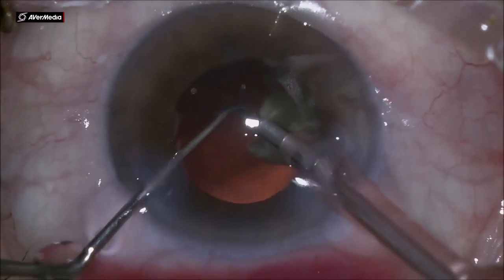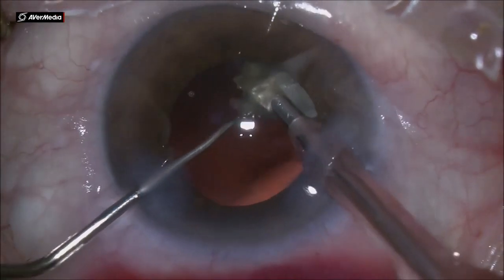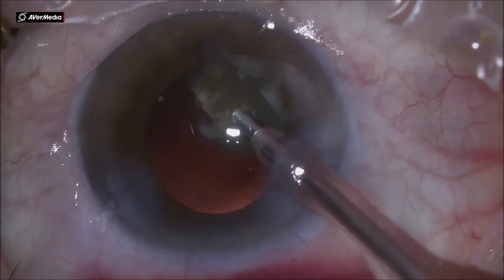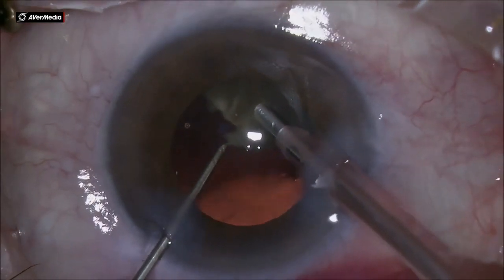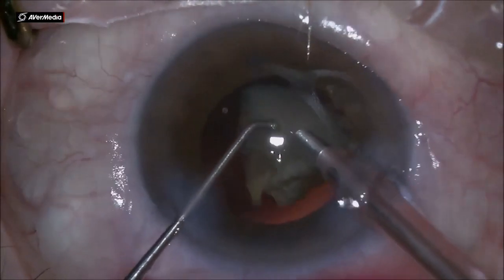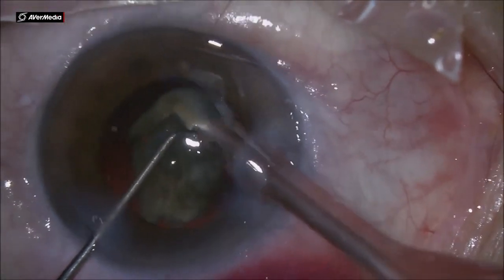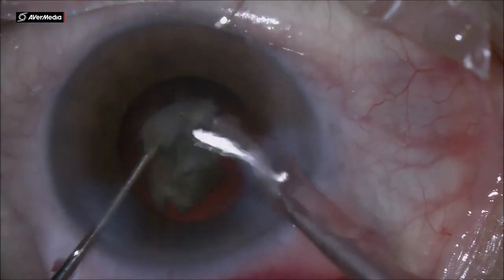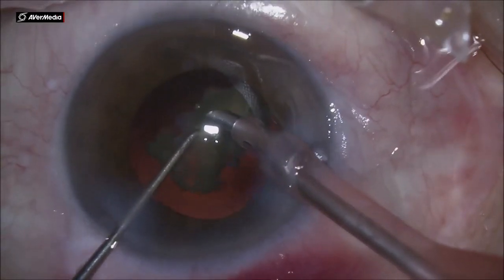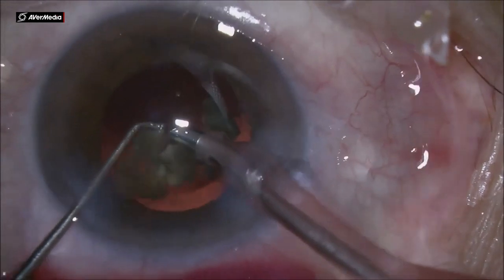This is especially important in elderly patients where the cataract is a very old one, as the posterior capsule is very fluctuating. I am changing the tip of the chopper now, using one with a ball tip so I can protect the posterior capsule. With that small remnant of leathery nucleus, I am almost finishing the phaco emulsification.